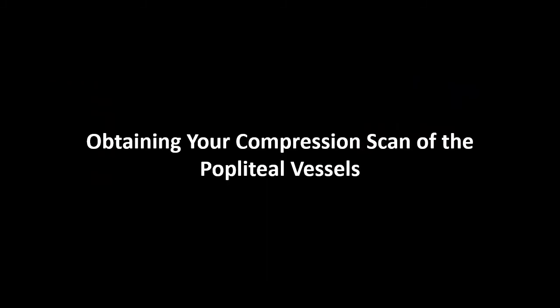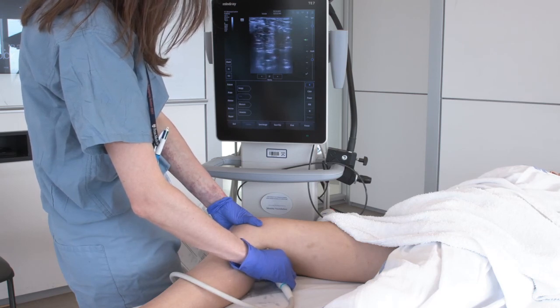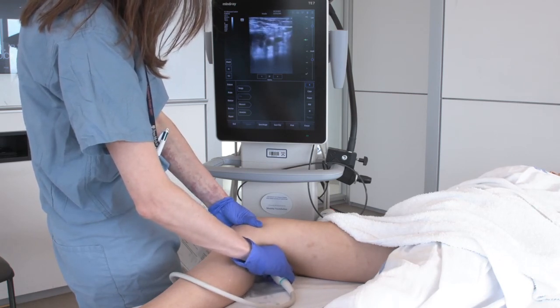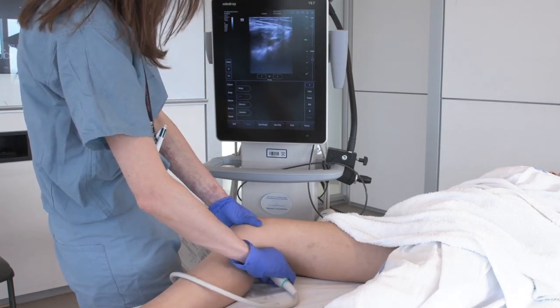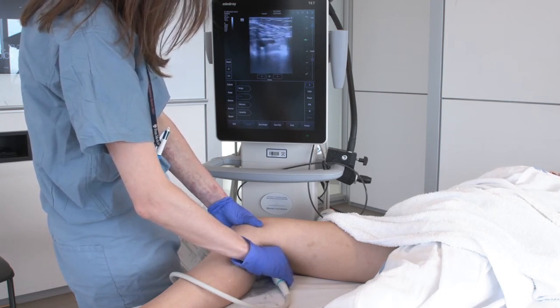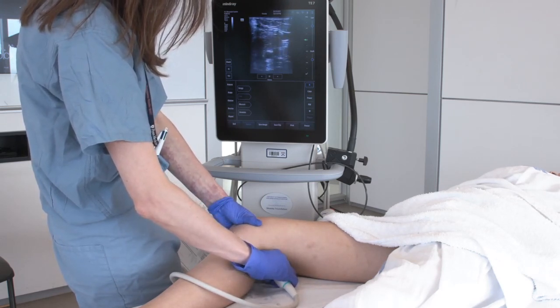Now let's talk about the compression scan of the popliteal vessels. Starting with a view of the popliteal vein and artery, gently compress the vessels until you see mild deformation of the artery, repeating this process about every centimeter until you see trifurcation of the popliteal vein and ensuring to compress at branch points. Here we see normal compression of the popliteal vein as well as normal compression of the trifurcation into the calf veins. Note that this patient's popliteal vein runs lateral to her popliteal artery, whereas in most people it will be superficial to the artery.